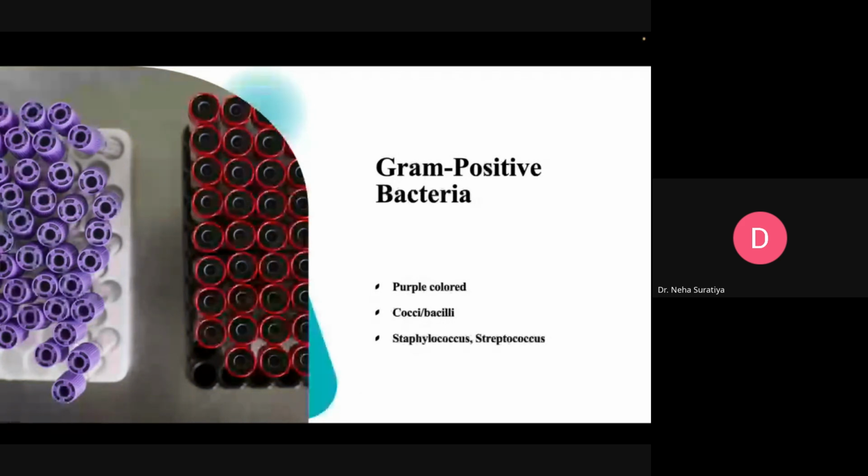As I told you earlier, gram stain gives you the shape of the bacteria, and a lot is decided from the shape. So if it says rod shape, that is bacillus and clostridium. Okay, so this is how you can relate.